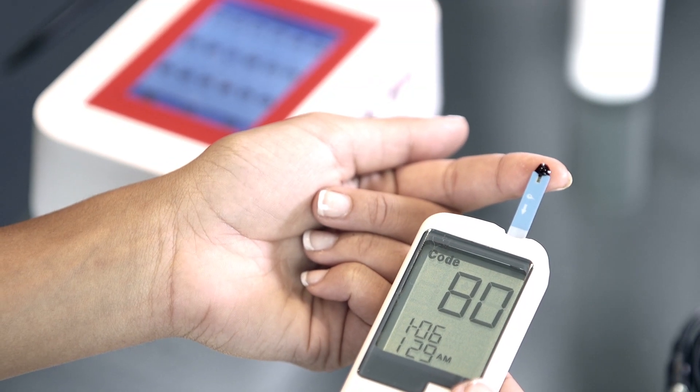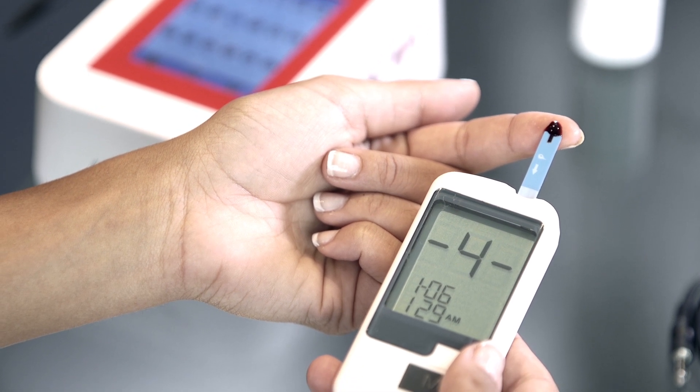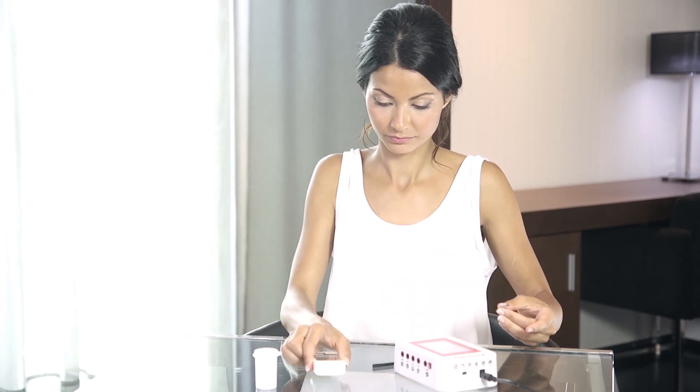Place a drop of blood at the top of the strip. The Glucometer Sensor will take a few moments to calculate the blood sugar reading. Once you see 'measure completed' on the MySignals screen, remove the strip to turn off the Glucometer Sensor.